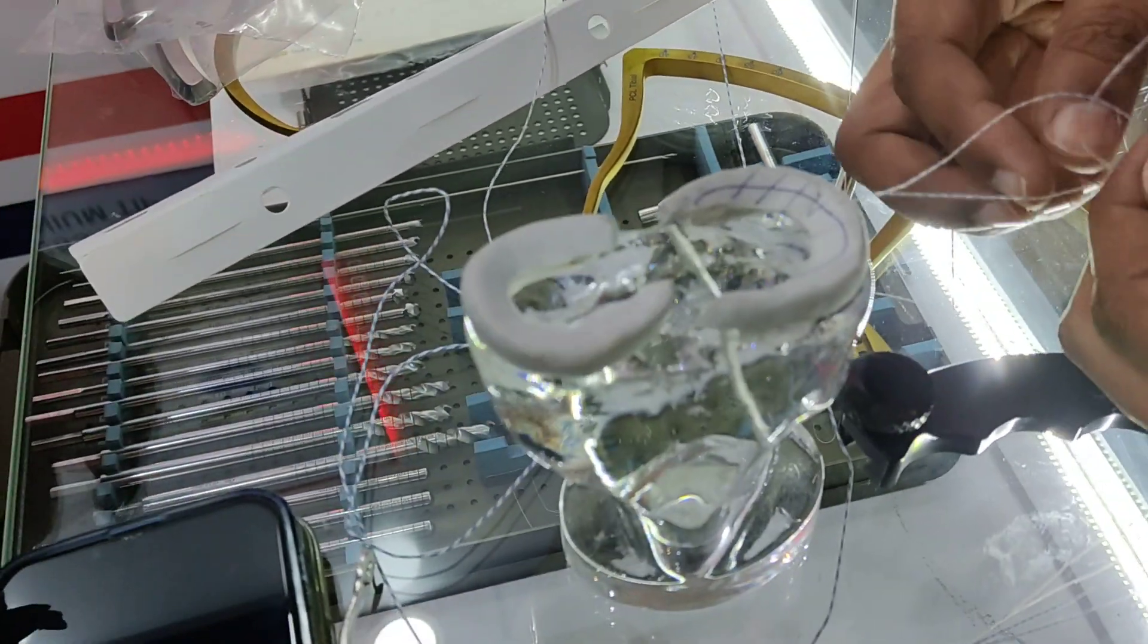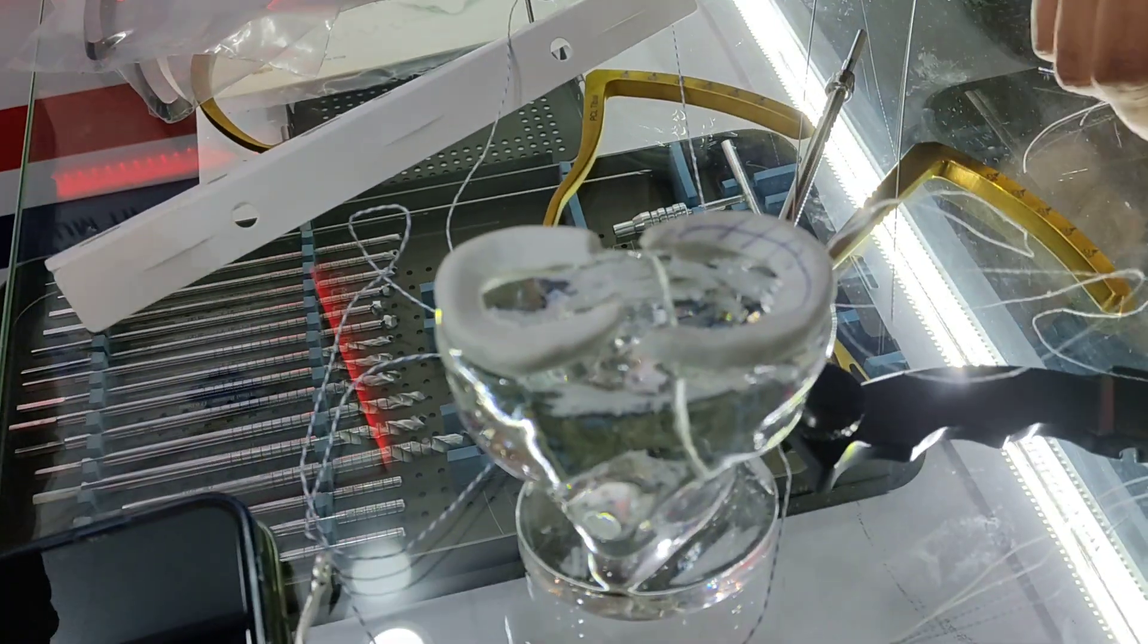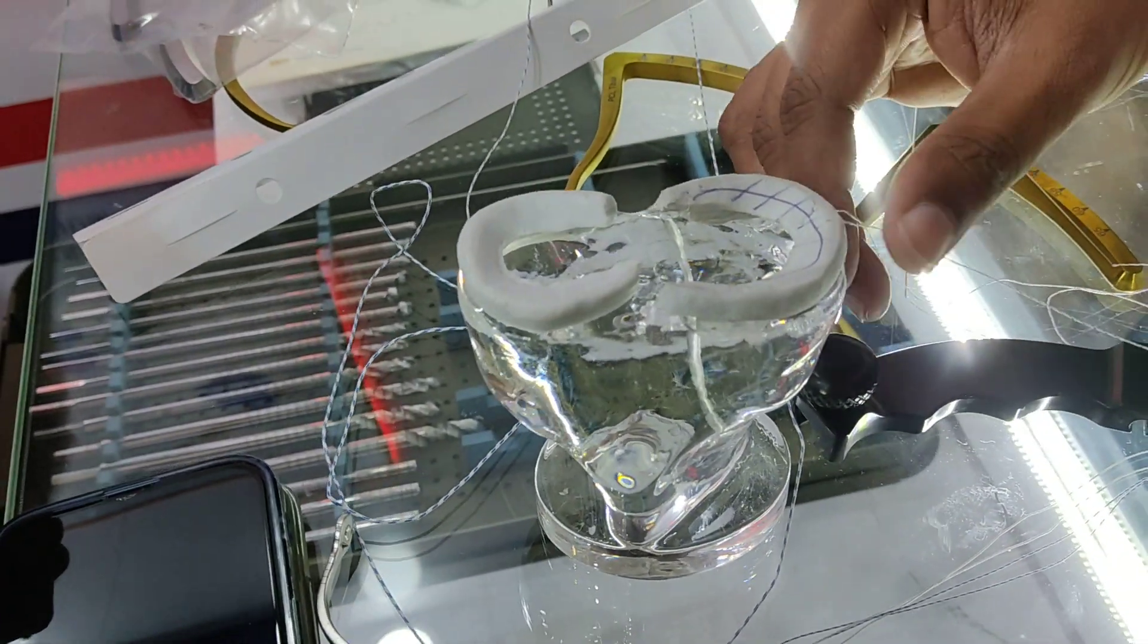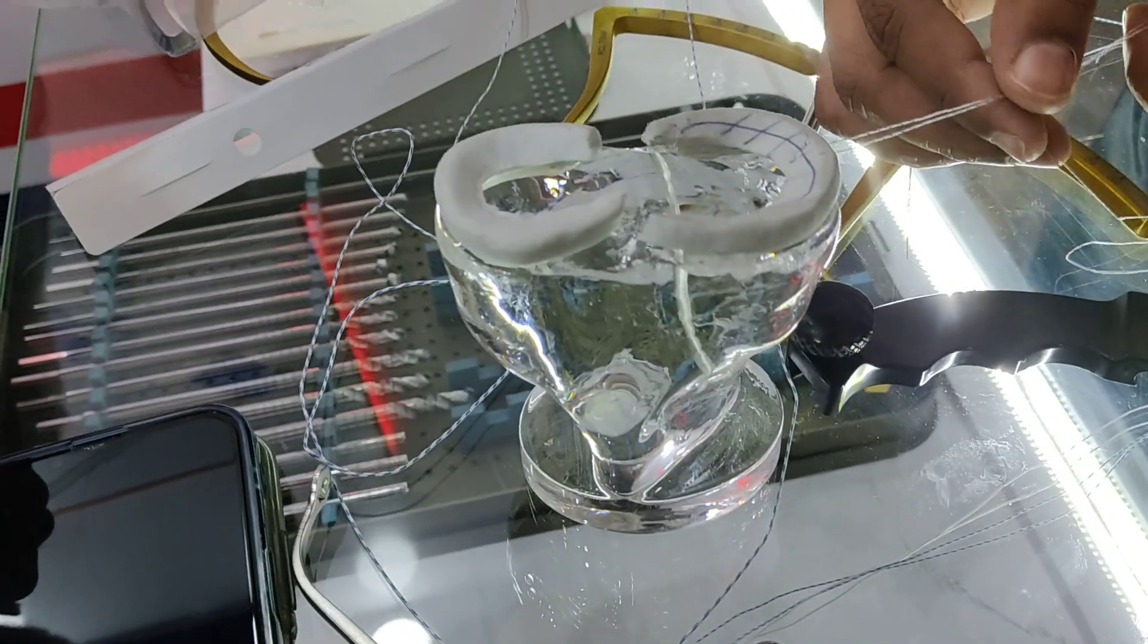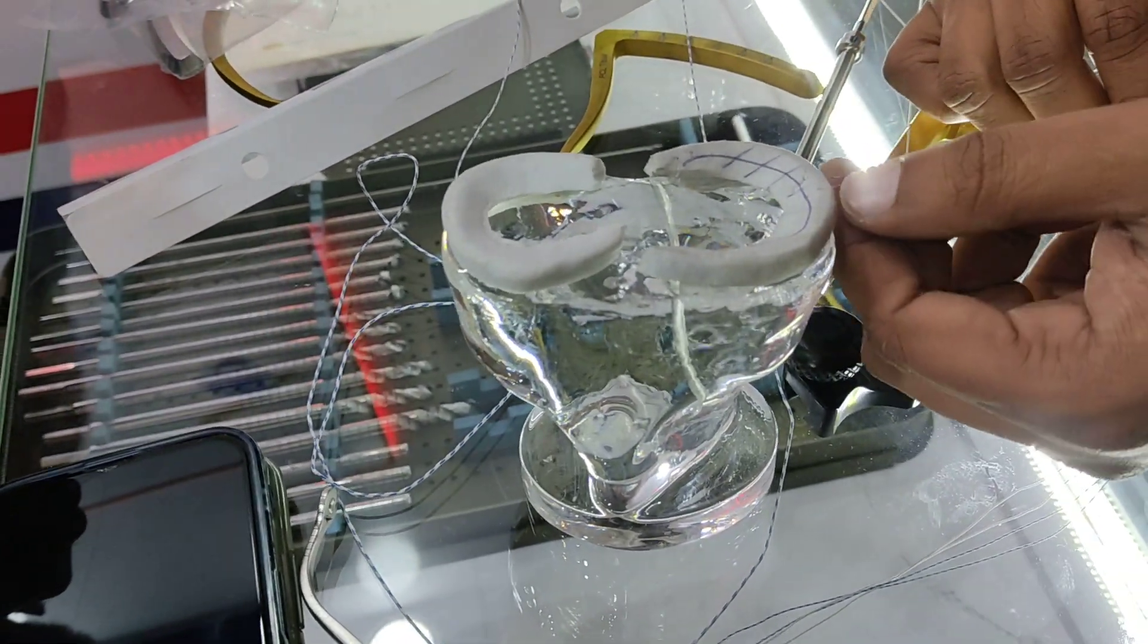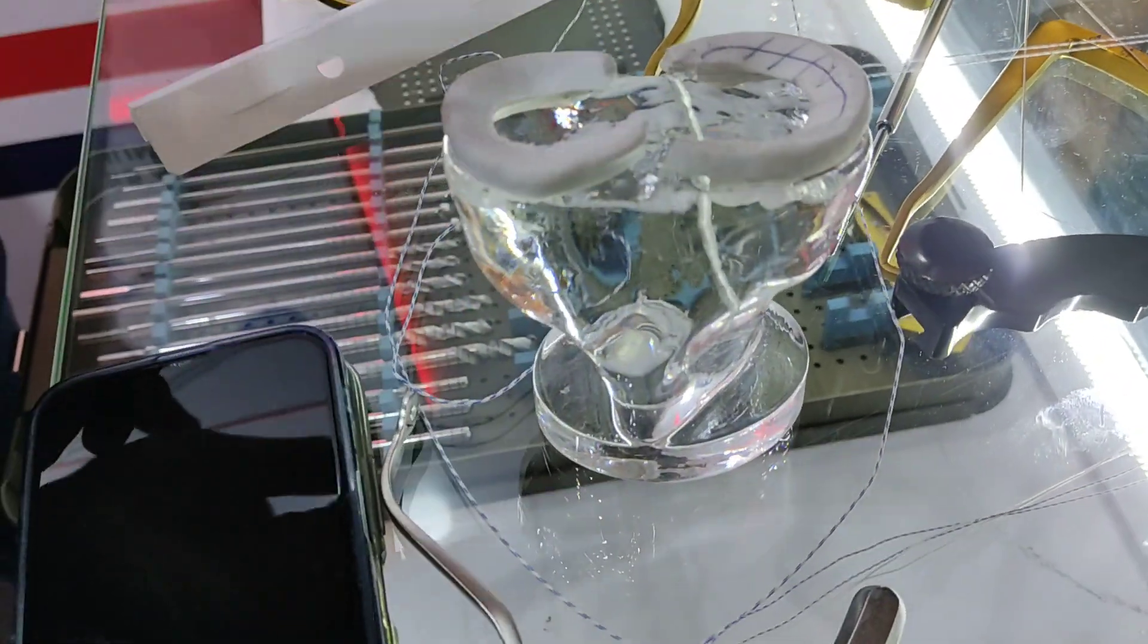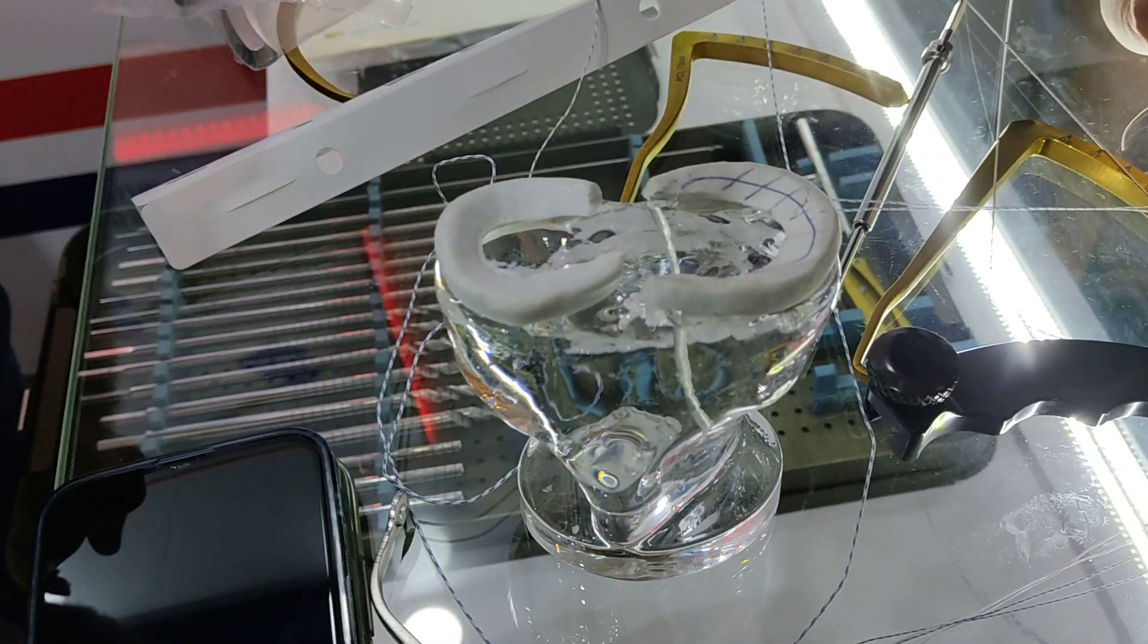This is the gold standard of doing a meniscus repair. Inside-out technique is considered to be the gold standard, and the repairs done by inside-out are the strongest as compared to the all-inside and the outside-in techniques.